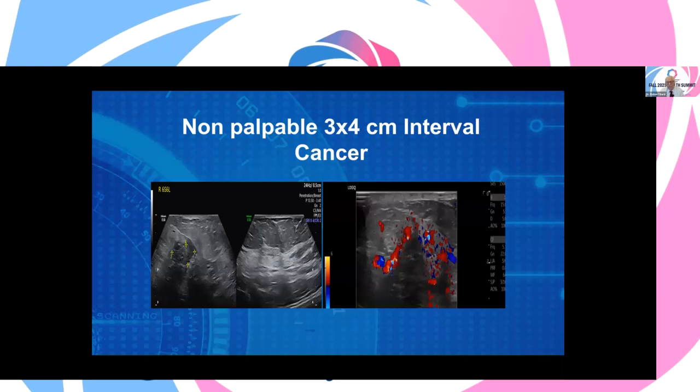So what's easy for people to do is get screened. We can put the ultrasound probe over the chest in less than a minute on each side. So we're able to scan for people who aren't sure or just want to get checked.